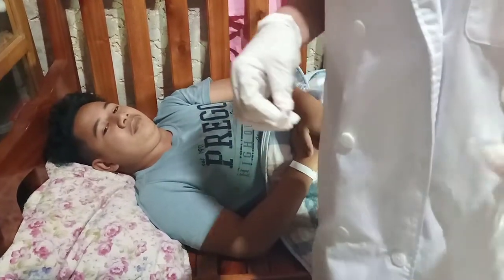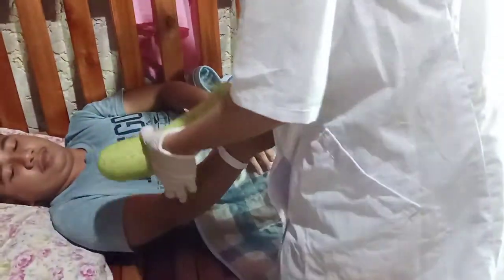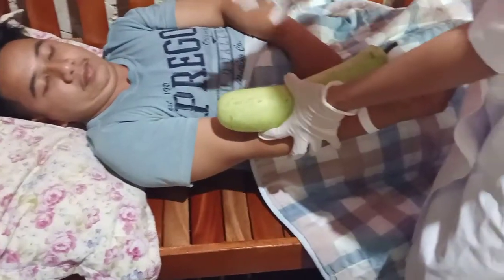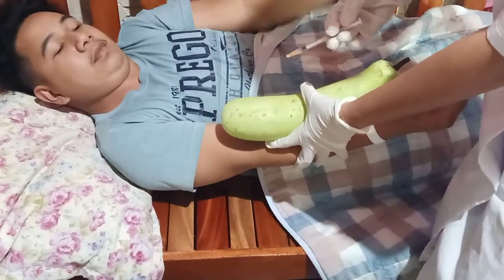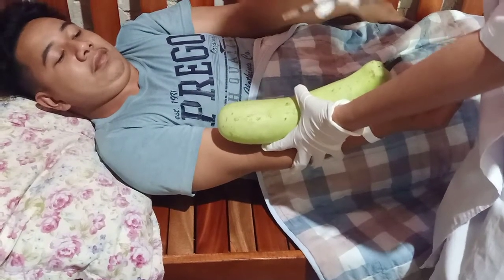Stretch the skin taut by gently pulling with the thumb and the 4 fingers of the non-dominant hand. And pierce the needle into the patient's skin. Insert slowly at a 5 to 10 degree angle until resistance is felt.